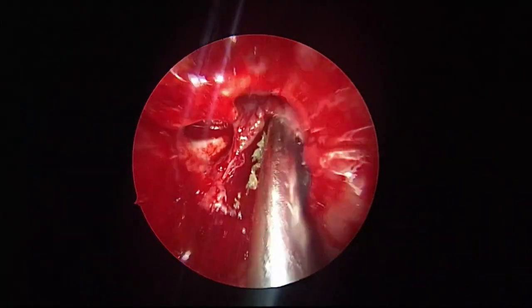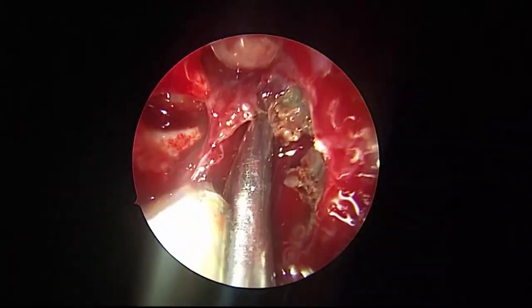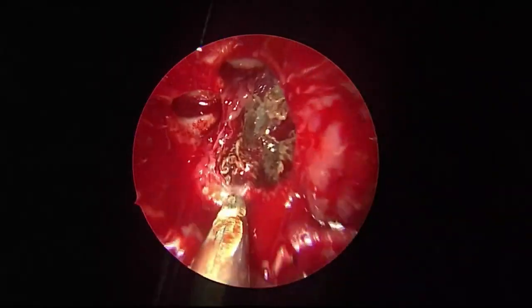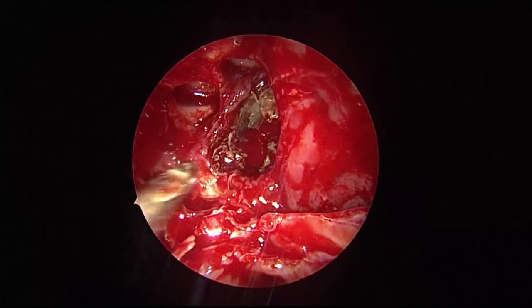Keep widening the sphenoid sinus to the maximum so that we can remove the fungus from there. Just a minute. Now the same strategy. Ball probe.